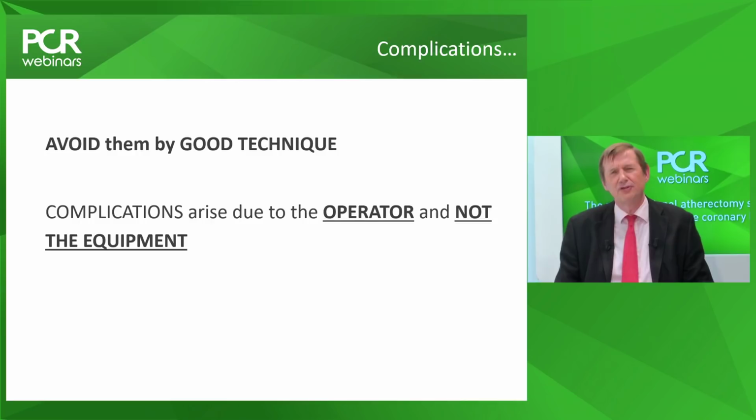But the strong message from us about complications is if you learn how to rotablate with good technique, then the complications will be much, much less. And having seen most of the complications that have happened in the UK over the last 15 years, I can assure you that they are nearly always due to the operator and not the equipment.